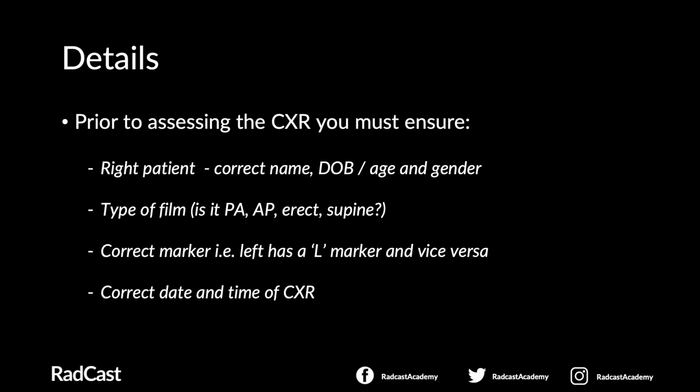Is it erect or supine? You must ensure that the correct marker has been placed, i.e. the left-hand side of the film has an L marker and vice versa. And finally, you must ensure that it is the correct date and time of the chest X-ray you want to look at.